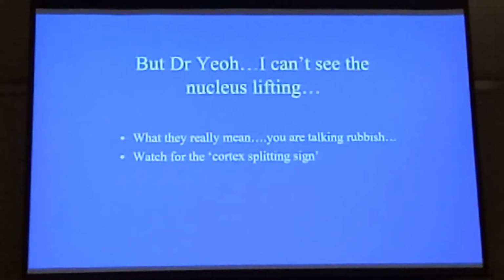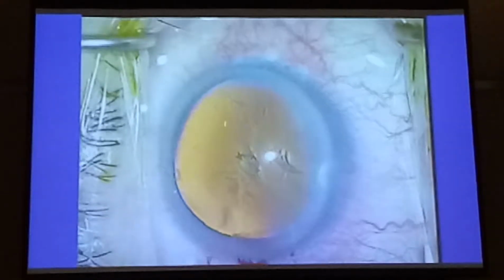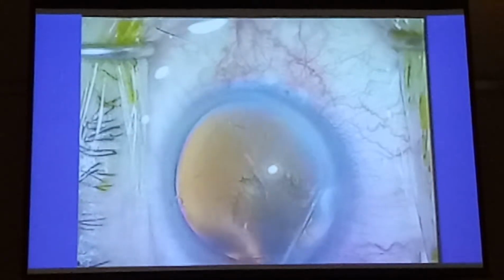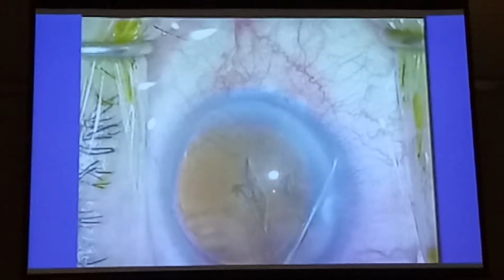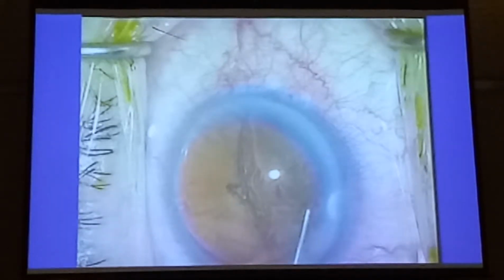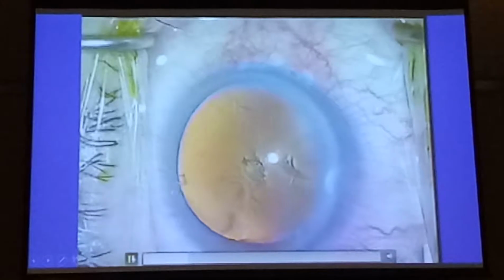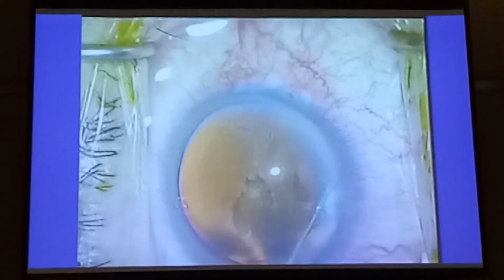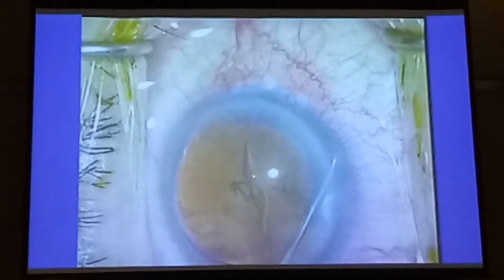So I tell them, okay, let's show one other clue to help you know that the nucleus is lifting. You can see that the cortex splits. You remember, when you're hydrodissecting, if the nucleus comes forward, you've got a layer of cortex. Now watch this cortex here. As it goes, the wave, the lift, that's the split. Have you seen that before? If you haven't, it's because you didn't look for it. So next time you do your hydrodissection, I'll show it to you one more time because it's quite a nice clip, this one. Things happen quite quickly, like I say, it takes 1 or 2 seconds. Once hydrodissection starts, the wave, that's the lift. How do you know? That's the split.